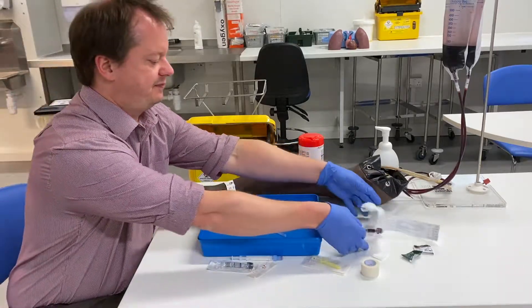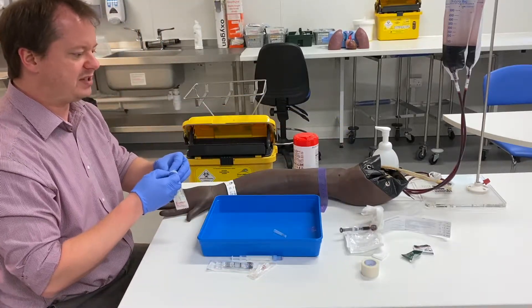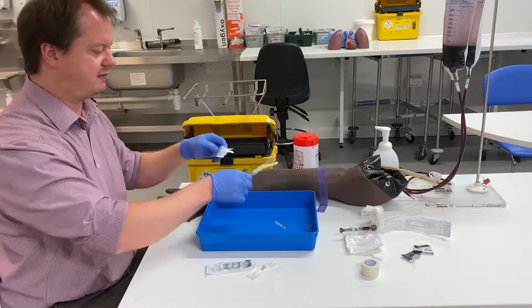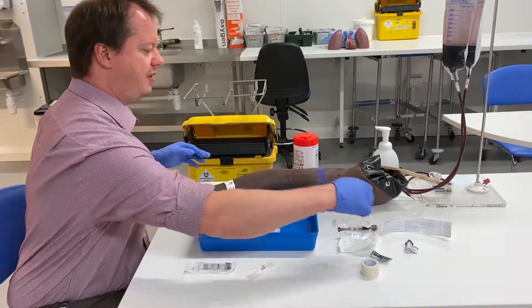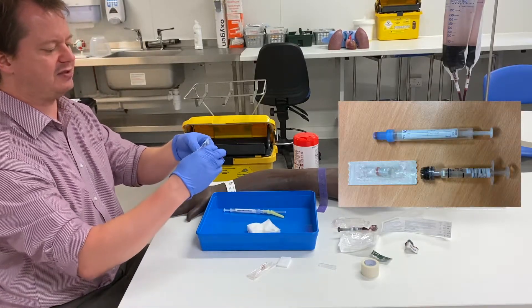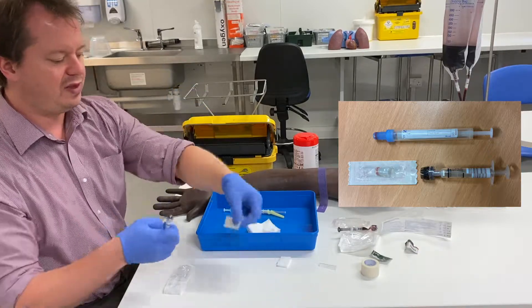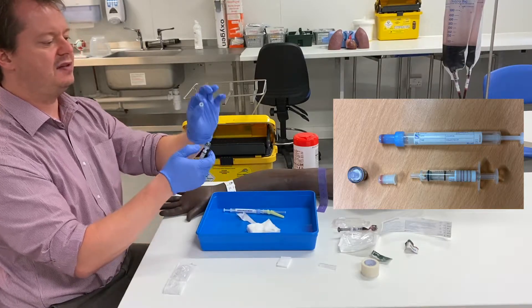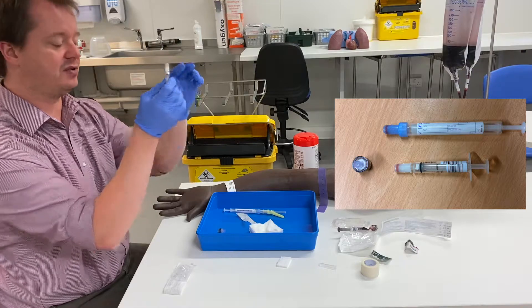So that's taking it as a standalone test. If you're going to take it as part of an order set, we would have obviously done all the stuff that we learned in phlebotomy — connected our blood bottle to our needle. As part of your preparation, it's important to also collect a needleless blood gas syringe, which is called an aspirator. With this, you also need to collect an adapter — these are very small adapters that will turn this syringe into the same connector as the blood bottles that you normally have.